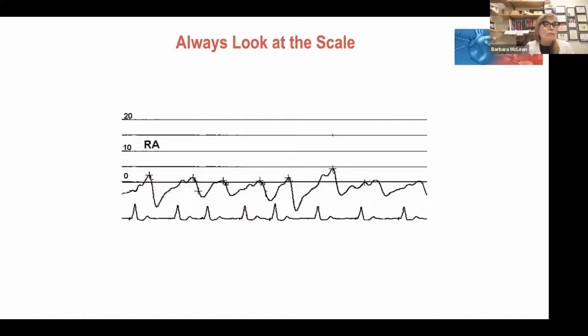Okay, so first and foremost, I want to remind you that venous pressure typically is small. So you need a small scale to look at that venous pressure. Sometimes you might walk into the room and you see a digital reading: oh, the pressure in the central venous is 12, but I don't see any waveform. First thing you're going to do is make sure you have a scale that fits the pressure. Touch the waveform window, go to choose scale or optimize scale. That's probably the best, optimize scale. And the monitor will shift the scale to be appropriate for that pressure.